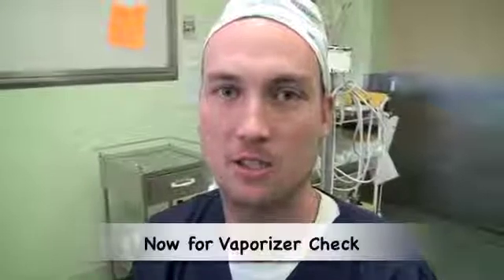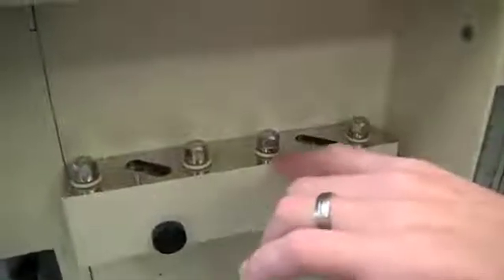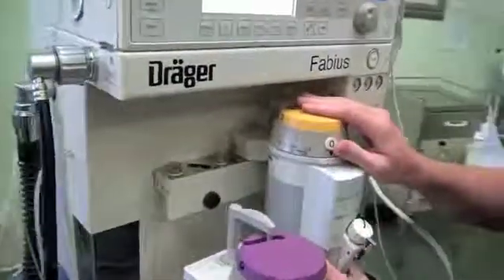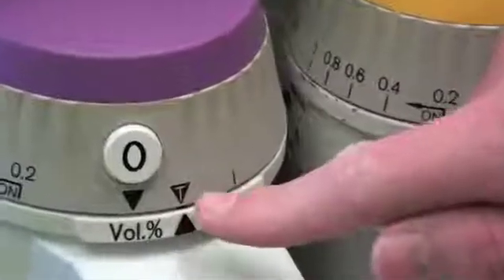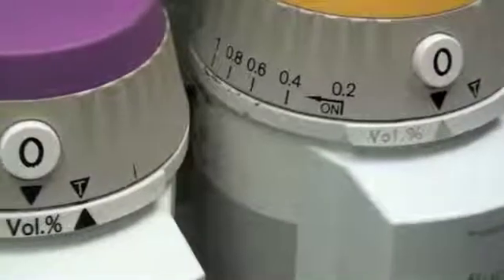Most anaesthetic machines will have space for two vaporizers. The vaporizers are situated on a back bar, and it is important to check the O-rings. When attaching the vaporizers to the machine, check that they are sitting flush on the back bar. These vaporizers have a transfer mode indicated by the letter T; when in this position, one can move a vaporizer onto or off the machine.